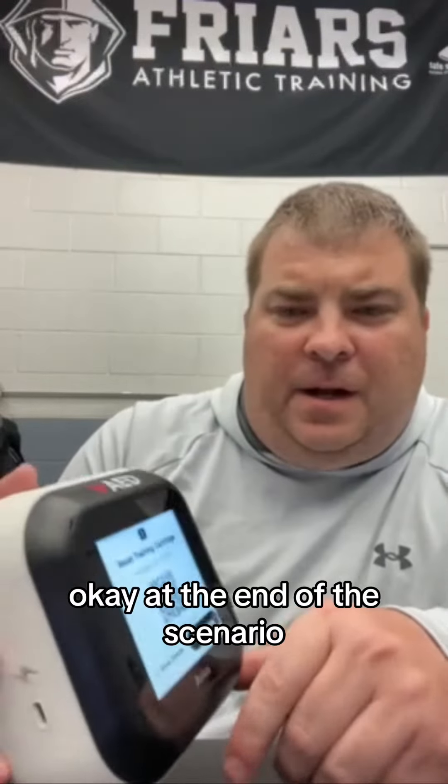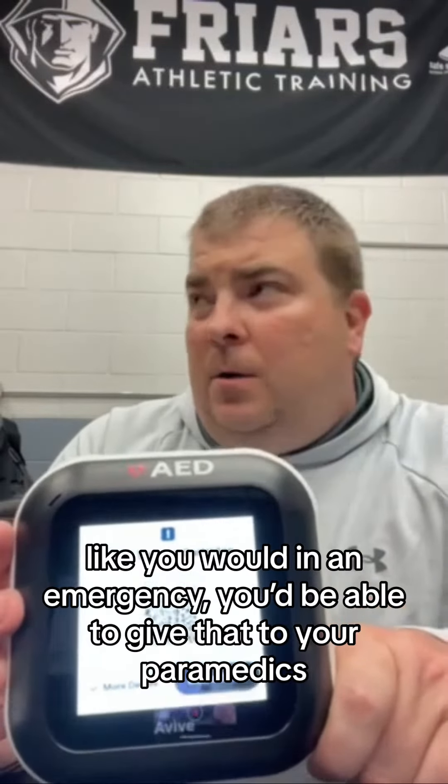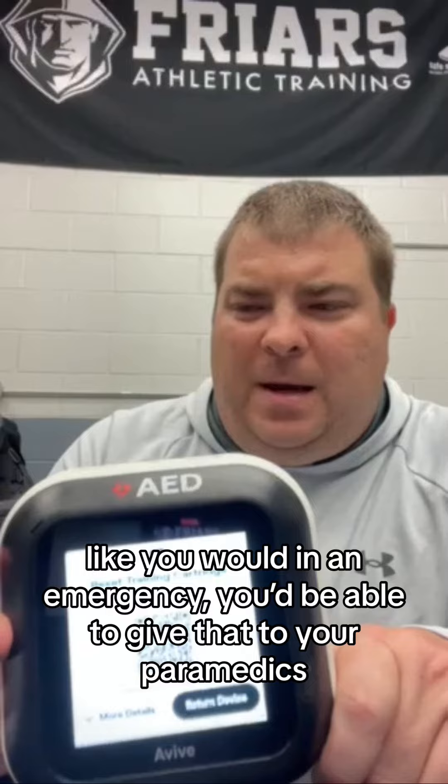At the end of the scenario, it pops up — there's your incident code. Just like you would in an emergency, you're able to give that to your paramedics, and away you go.